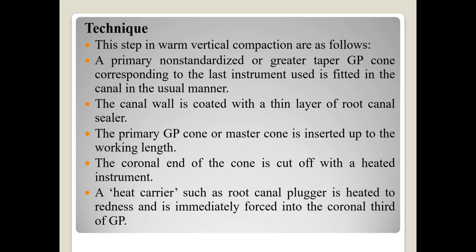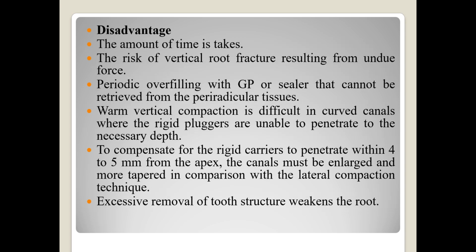A heat carrier, such as a root canal plugger, is heated to redness and is immediately forced into the coronal third of the GP. Disadvantages: the amount of time it takes, the risk of vertical root fracture resulting from undue force, and periodic overfilling with GP or sealer that cannot be retrieved from the periradicular tissues.